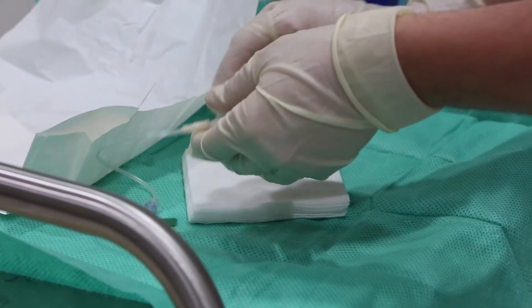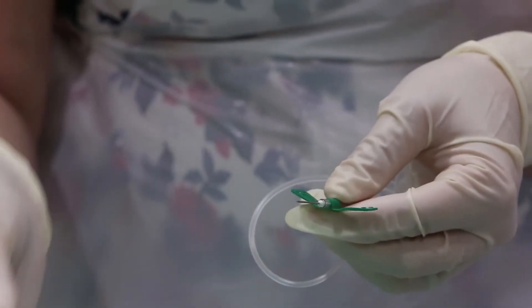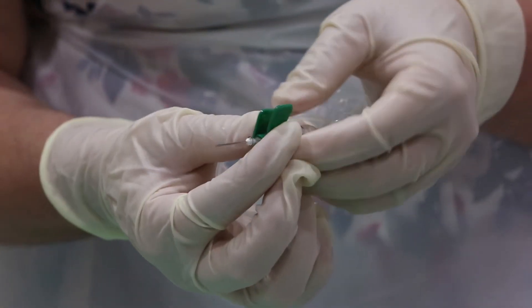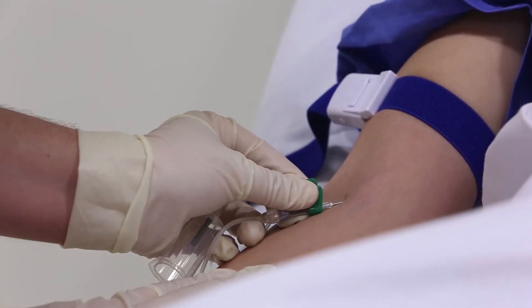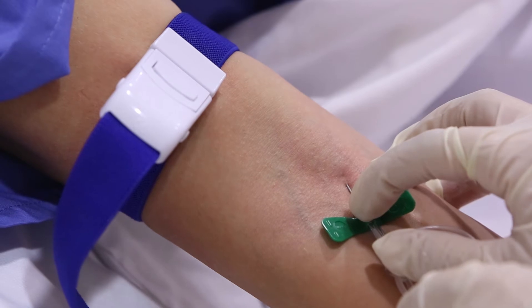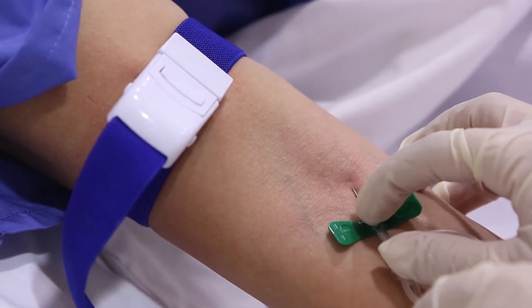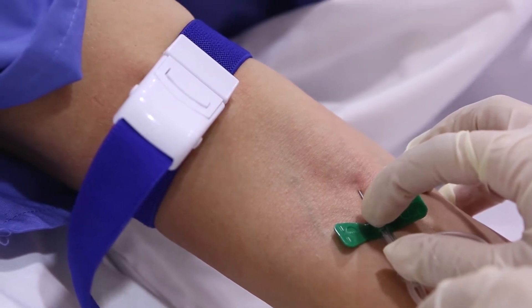Grab the safety blood collection set and remove the butterfly needle from its protective plastic cover. Perform venipuncture. Stabilize the butterfly needle onto the patient's skin, making sure to allow ease of access to the vacutainer holder.